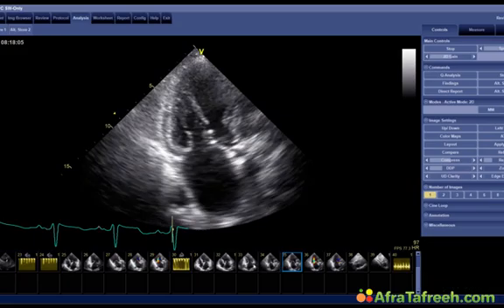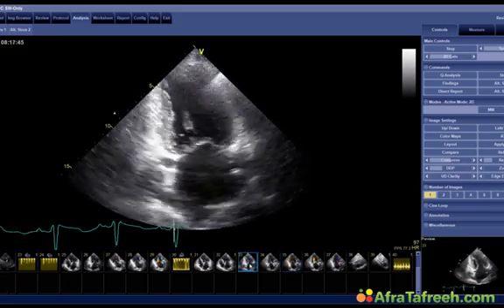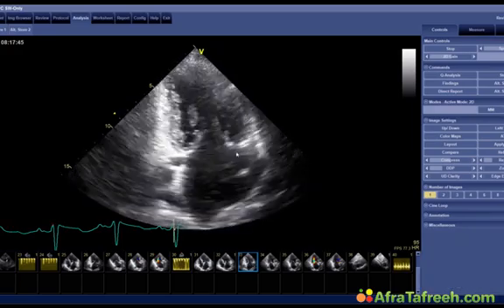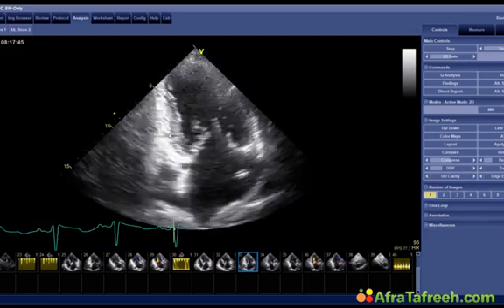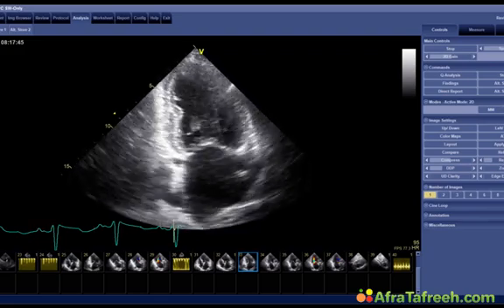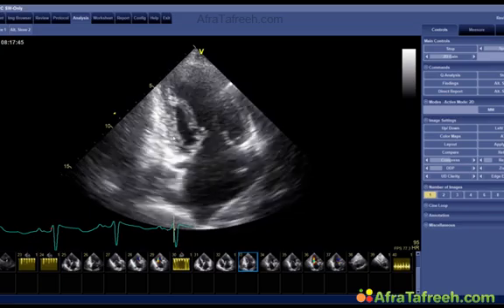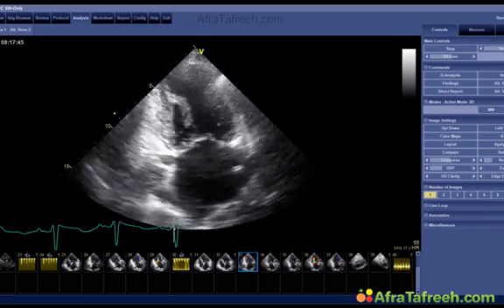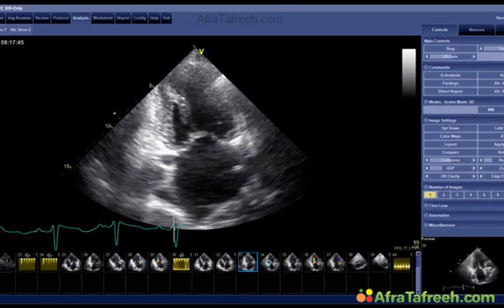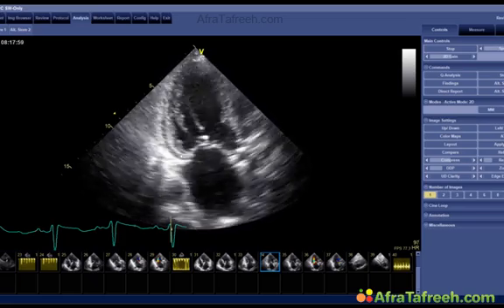But the reason I'm asking you the question is because I wanted to see if you catch the regional wall motion abnormality, which is also present in this patient. Here is the two-chamber view. Now, look at the inferior wall. This is not only hypokinetic, but it is simply akinetic. It's not moving. Look, here, there is no wall motion at all here, okay? So this is very suspicious of an RCA problem.